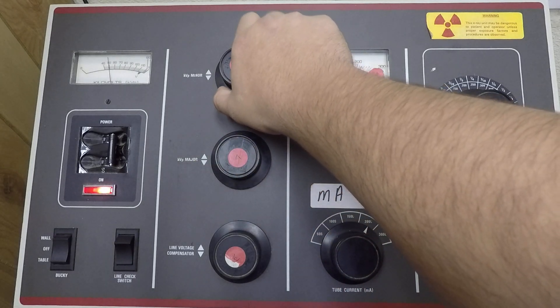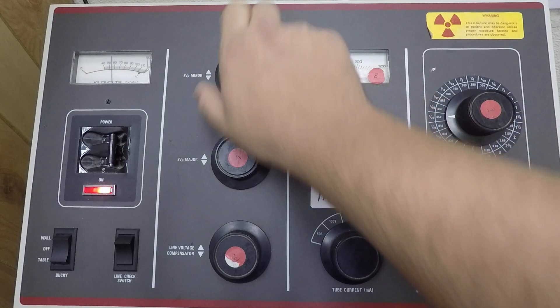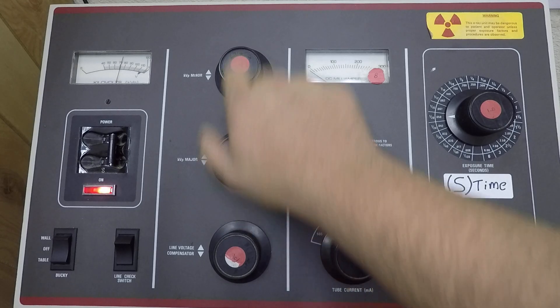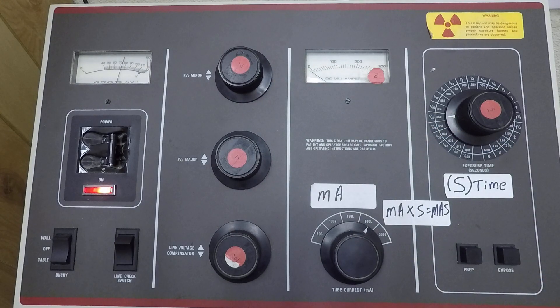The minor adjustment moves us by one to two KV at a time. So if I need to make big changes, I use the major adjustment. If I need to make small changes, I use the minor adjustment. A lot of other consoles will just have a KVP selection, in which case you'll just set it.